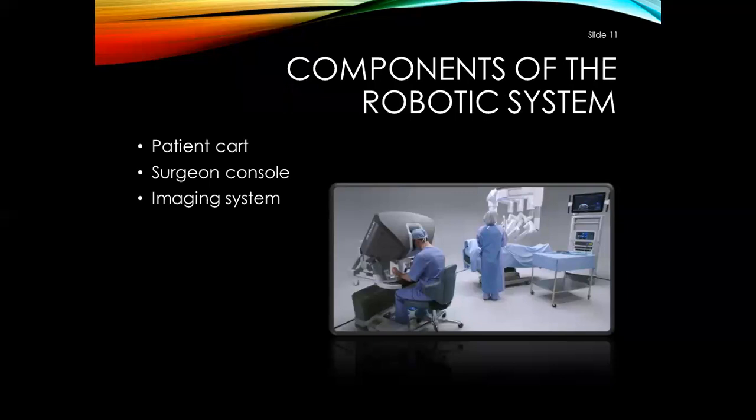Some components. There are the 3 components right there. You have the patient cart, and that's the arms here. It can be called something else, and I think I have it in the instruments I'm going to show you, but the patient cart is right here. The surgeon console is right here, and the imaging system is here. So if I ask you to name the 3 parts, it should be the patient cart, surgeon console, imaging system. Okay.